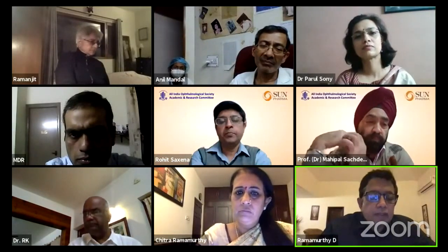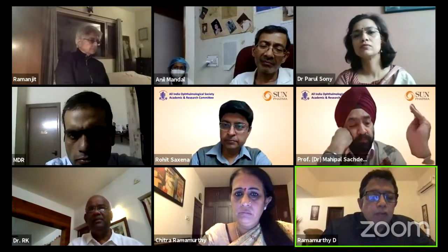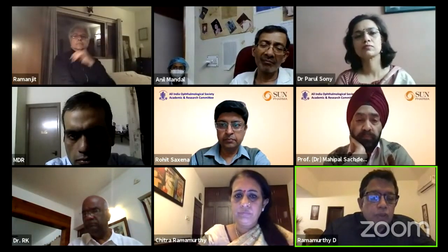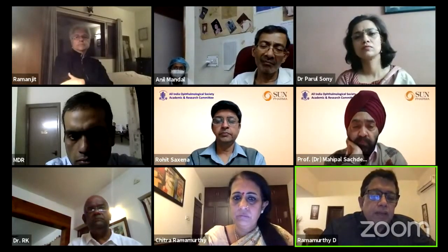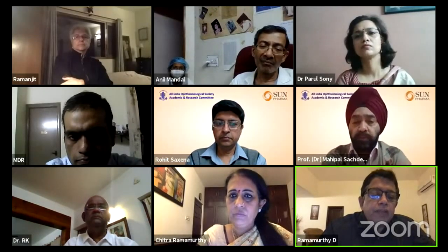Till about 3 to 4 years ago, I used to love my manual keratometer. That was the case for almost 3 decades. But today, I believe the technology has progressed to an extent where your optical keratometers and good auto keratometers give you extremely reliable readings, and definitely I would any day go by them rather than a manual keratometer.